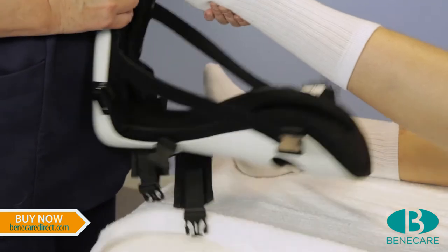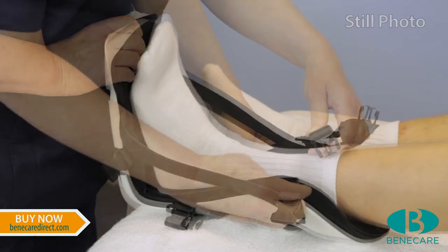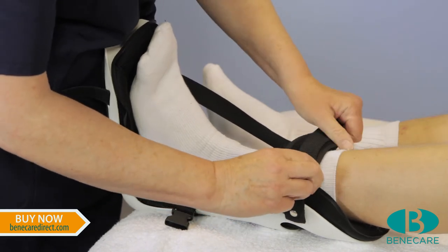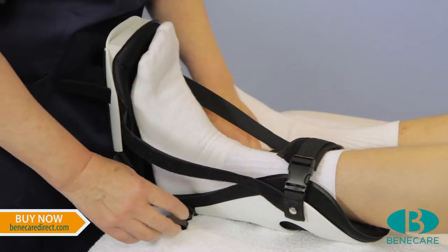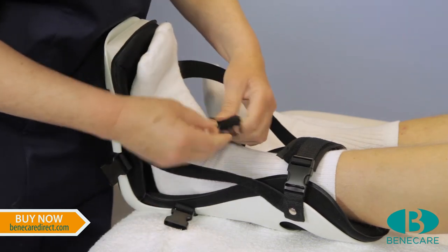Place the splint directly onto the limb. A sock can be worn if desired. Fasten the buckles and pull the strap to secure. Ensure the soft padded cuff is positioned to protect the limb.